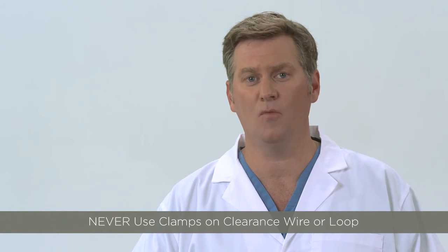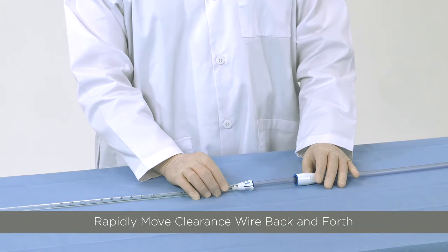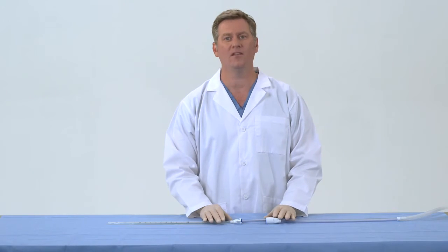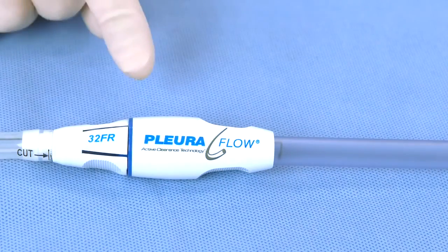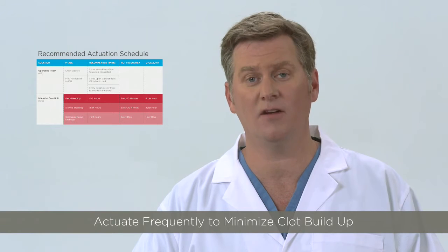Never use a clamp on the wire or loop. Rapid movements of the wire backward and forward may also help dislodge the clot. Remember, the objective is to clear the clot into the larger guide tube. When the clot has been broken down and removed, replace the clearance loop into the parked position. Keep in mind, more frequent actuation of the device helps minimize clot on the guide wire and loop.